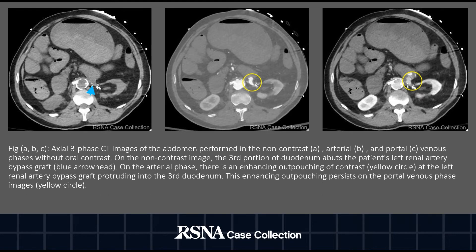Axial three-phase CT images of the abdomen, from left to right, were performed in the non-contrast, arterial, and portal venous phases without oral contrast. On the non-contrast image, the third portion of the duodenum abuts the patient's left renal artery bypass graft, as demonstrated by the blue arrowhead. In the arterial phase, there is an enhancing outpouching of contrast demonstrated by the yellow circle at the left renal artery bypass graft, which protrudes into the third duodenum.